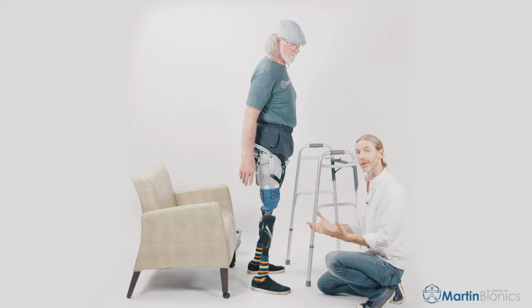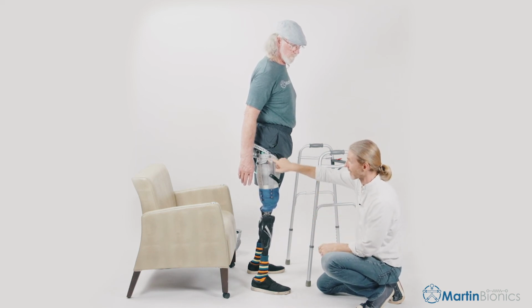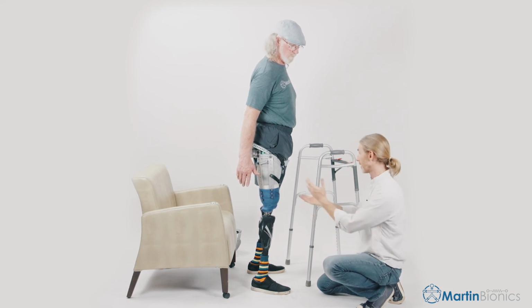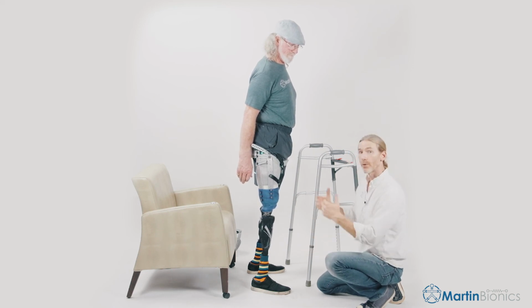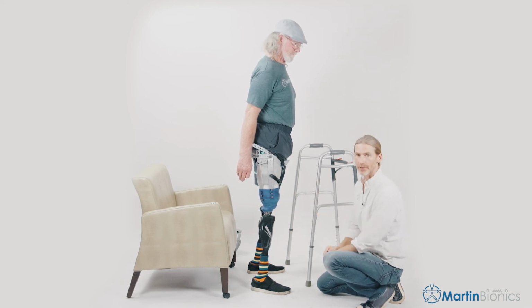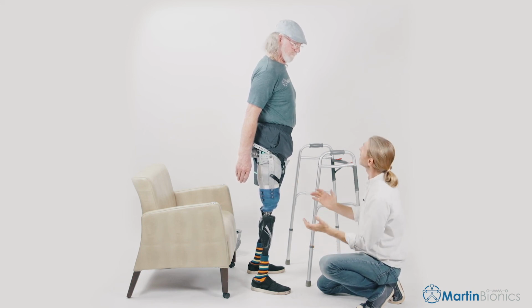So our adjustability parts to the fit are just changing a couple cross connectors to the right length, pulling the webbing tight, and you're done. Here we really didn't have to adjust anything at all. That's often how the fittings of these go. So the fitting part itself, what we're doing right now, is predominantly focused on just aligning the socket as you normally would. But the fit itself should be pretty fast and easy. All right, well that's it.